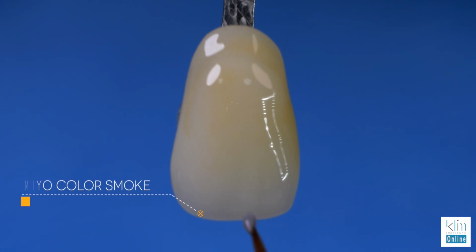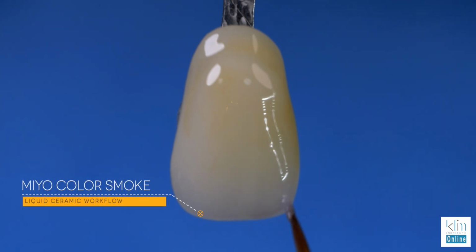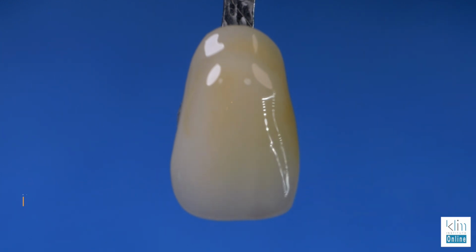To build the incisal effects, we start with smoke. That's the foundational color, bringing the value down, creating that incisal translucency, working it around the line angles into the primary depressions. Now here on the distal, if you want to add more color, we're going to do it twice. We're going to bring back and add a little bit more. It's like painting.